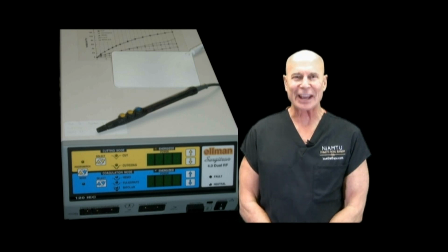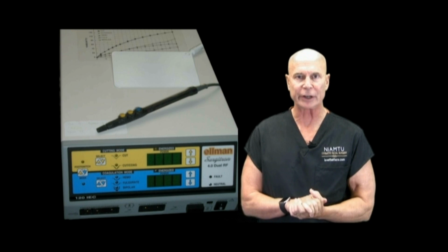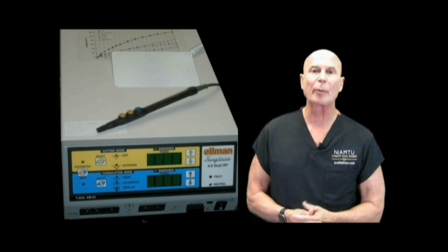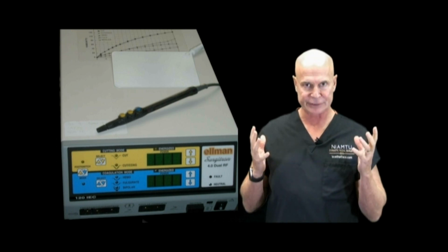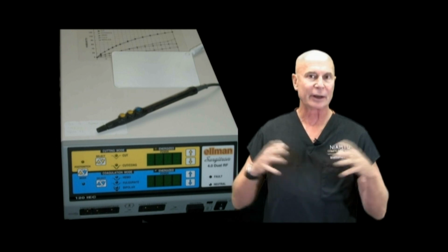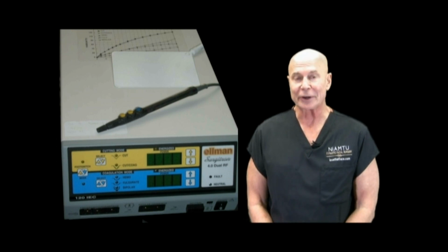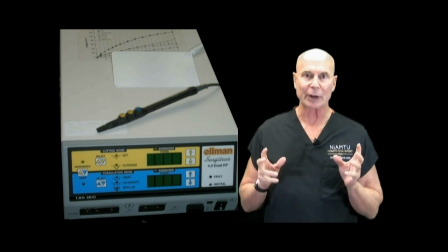Hi, I'm Dr. Joe Niamtu, LoveThatFace.com, and if you follow our YouTube videos, you know that I use the Ellman Cynosure 4.0 megahertz radio wave system a lot in my cosmetic facial surgery practice. This system is applicable to just about every specialty where there's anybody that does any surgery on humans or in veterinary medicine as well. Radio wave surgery is different from electrosurgery.